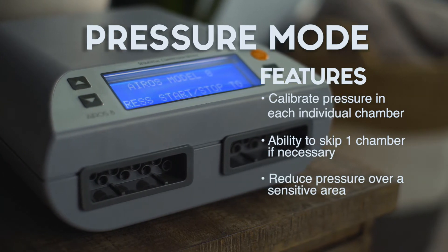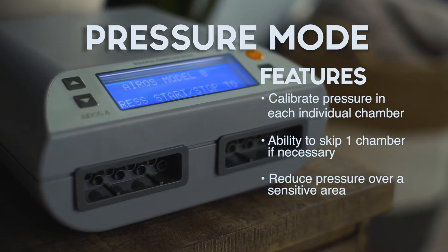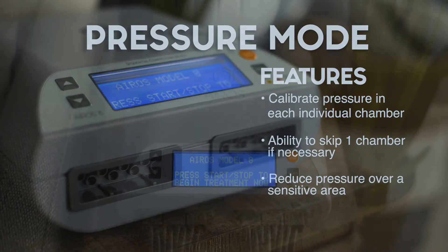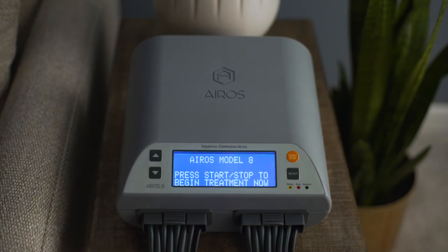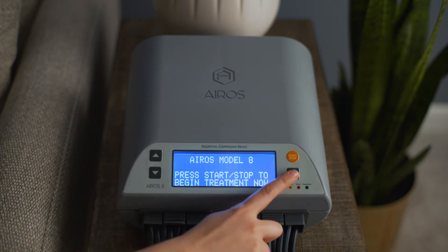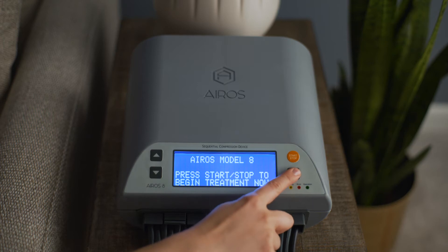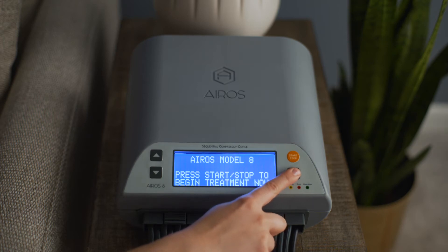After the Aeros8 device is turned on, the startup screen will be displayed. The user can begin treatment immediately by pressing the orange Start-Stop button. To set the main therapy mode, pressure, cycle time, and other operating parameters, press and hold the Select button for 5 seconds.